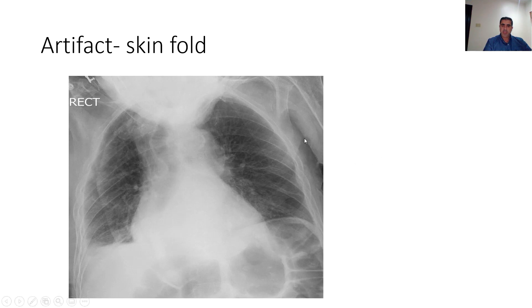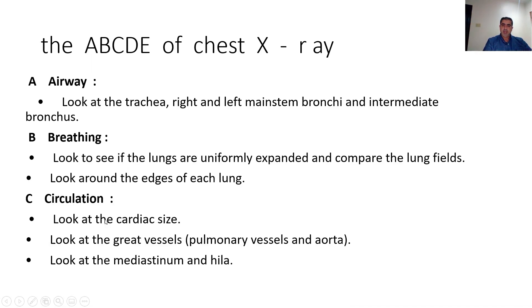The last component in quality judgment is artifacts. One of the most common artifacts in neonatal units is the skin fold. Many times X-rays are reviewed for suspicion of pneumothorax and it turns out to be just a skin fold. You can confirm it is a skin fold when you can see lung tissue lateral to the fold, as you can see here.